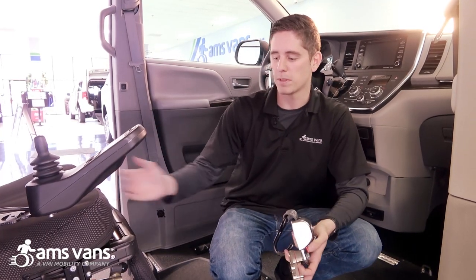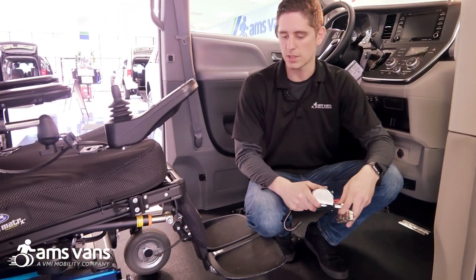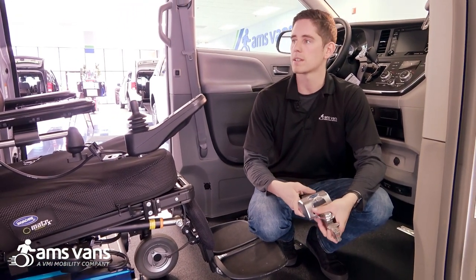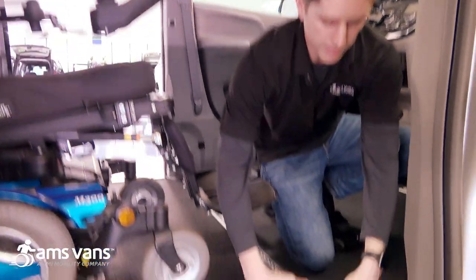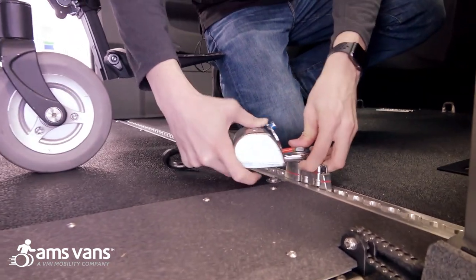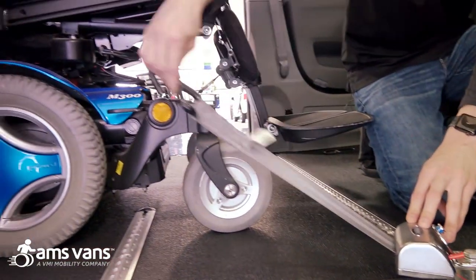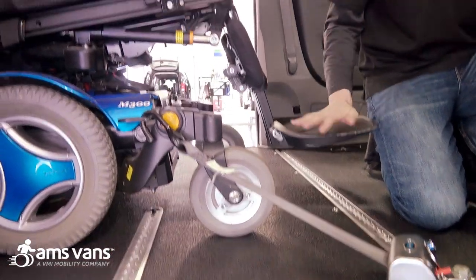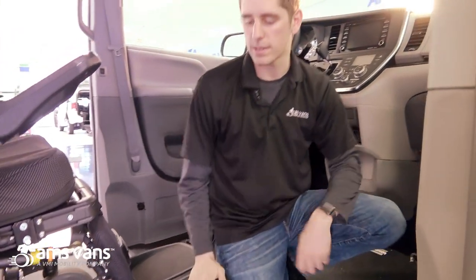As you can see we've got a Permobil M300 in here. I'm in the midship position so we're going to show you how to lock the wheelchair down. This is an upgraded lockdown device — these are our Q-straints. The van comes with a set of manual straps. All we're going to do is attach this into the L-track — you're going to hear it click in — and then attach it directly to the chair. You do two in the front, two in the back, and the person in the wheelchair is going to ride here, along with the seat belt extension.